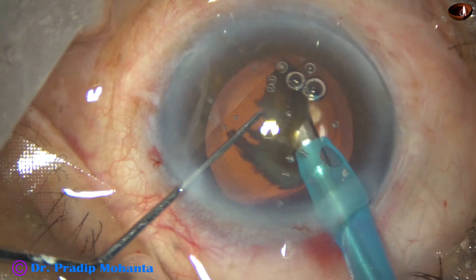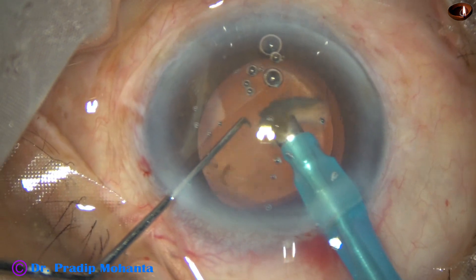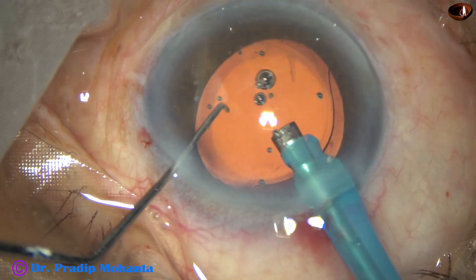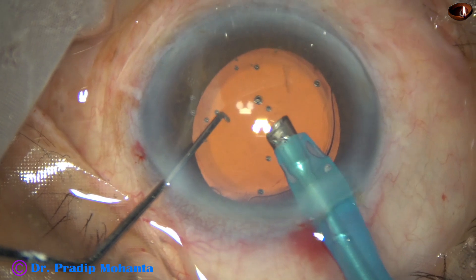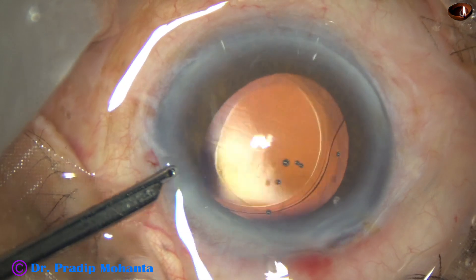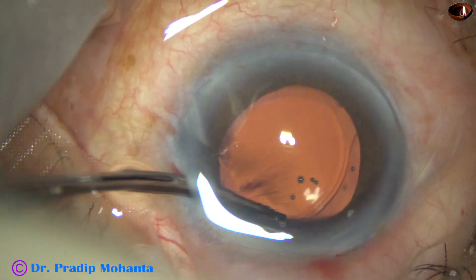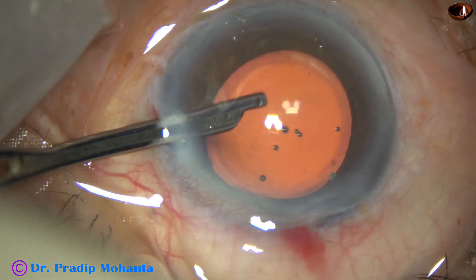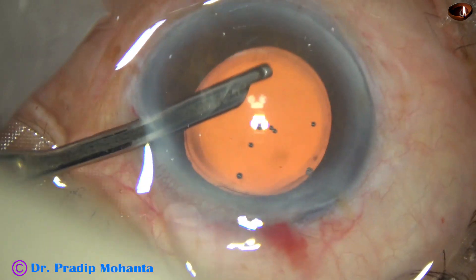At the iris plane, keeping the phaco needle deep at the center of the anterior chamber, the piece is emulsified. There is almost no cortex, but there is some little cortex at 12 o'clock. That cortex is removed with the help of this 23-gauge Simcoe cannula.